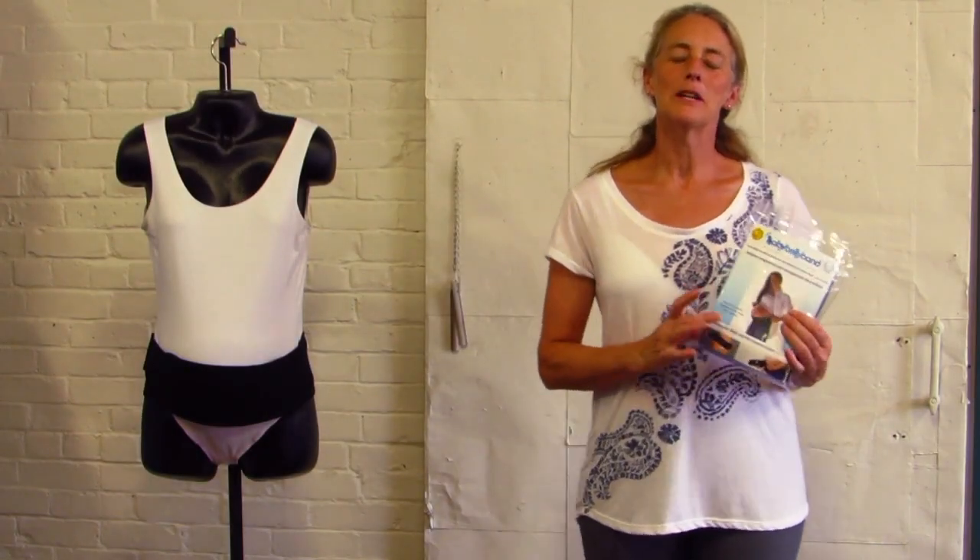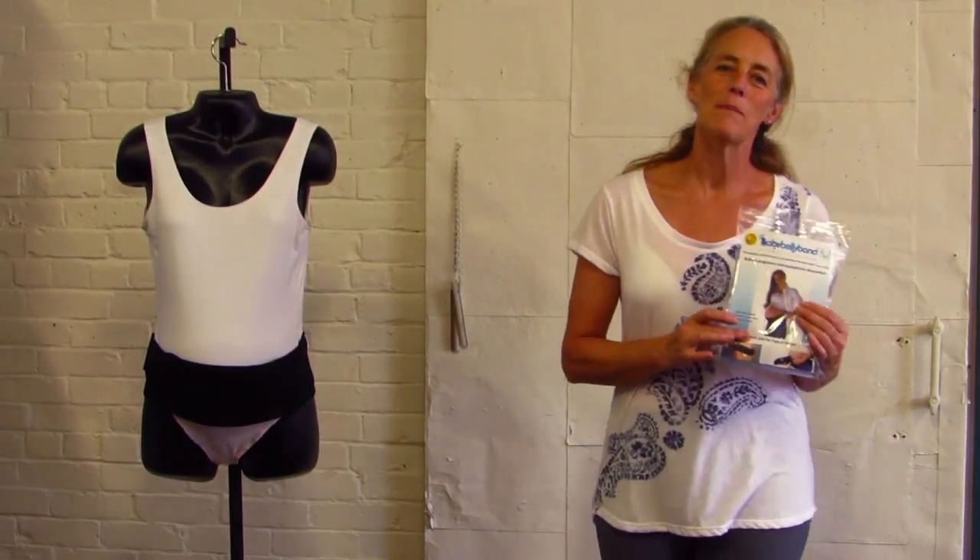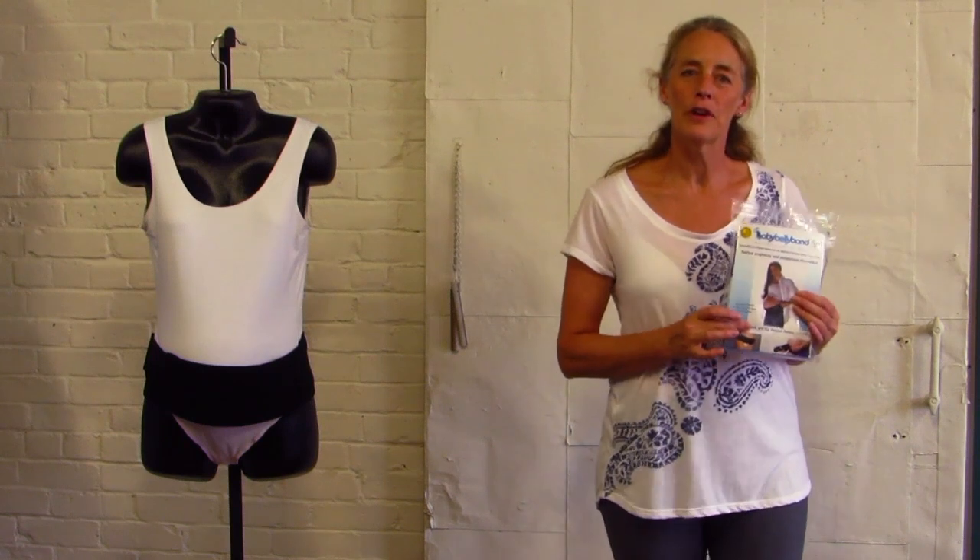Hi, I'm Caroline with Baby Belly Band, and I'm going to show you how to use the Baby Belly Band products for vulvar varicosity support.